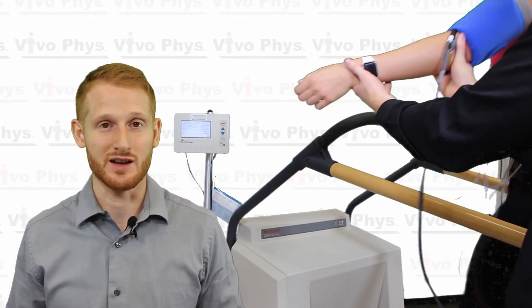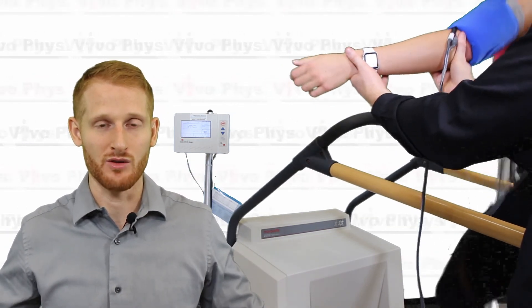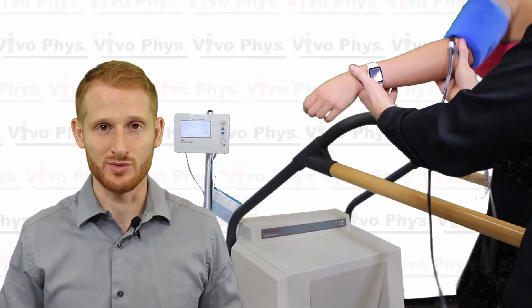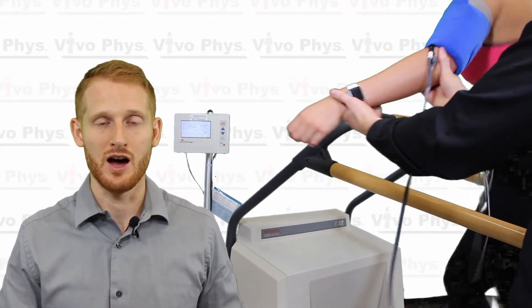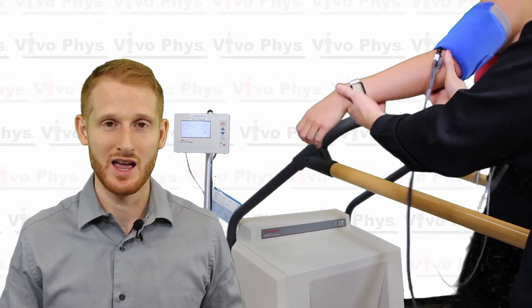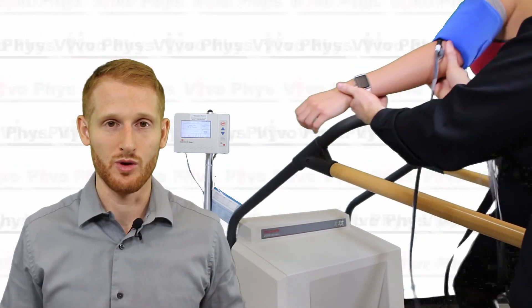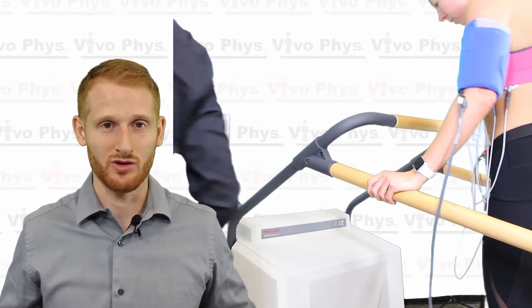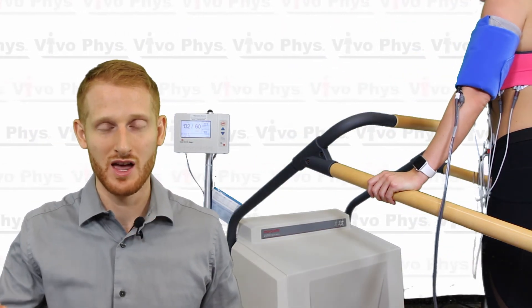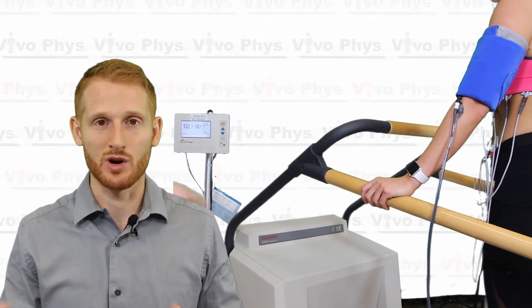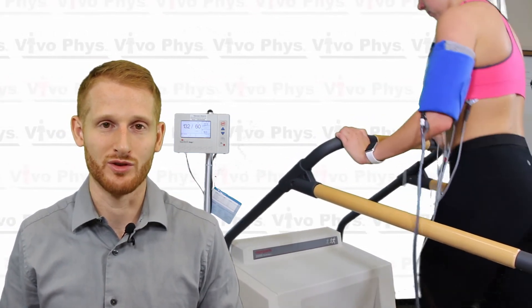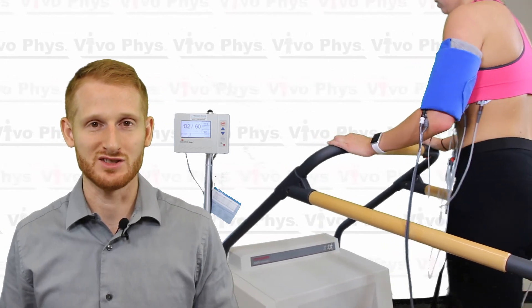When you get to peak exercise, when they grab and straddle the belt, always make sure that you get all those measurements I listed. So RPE, an ECG tracing as well as a blood pressure measurement. I recommend doing all those immediately after they've grabbed and straddled the belt and after the ECG signal has become much more clean. That's going to give you the best signal that you can use so that you can try to interpret whether there's changes with exercise.